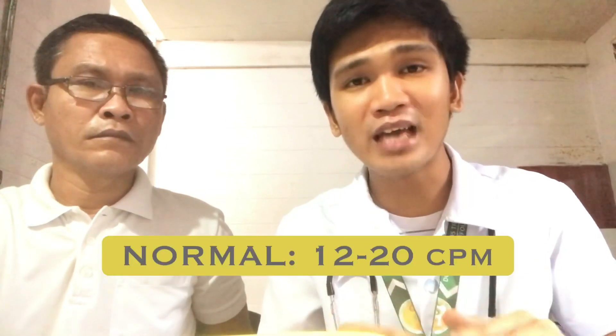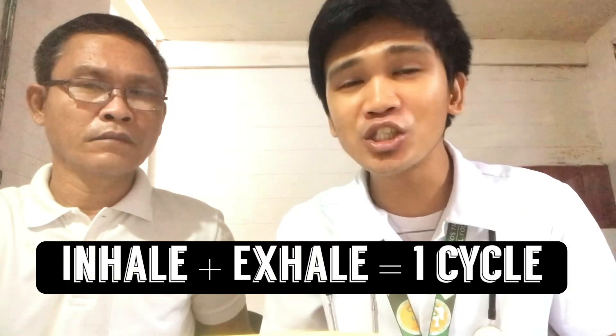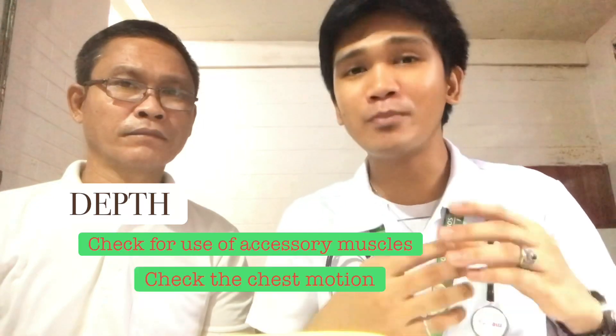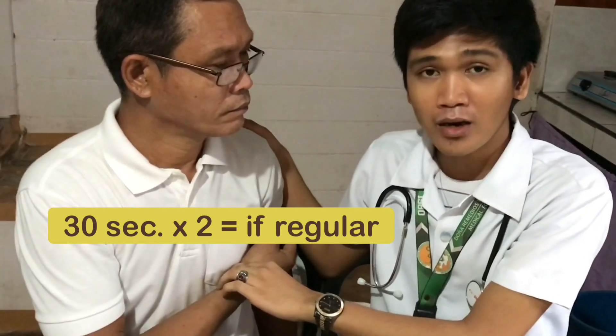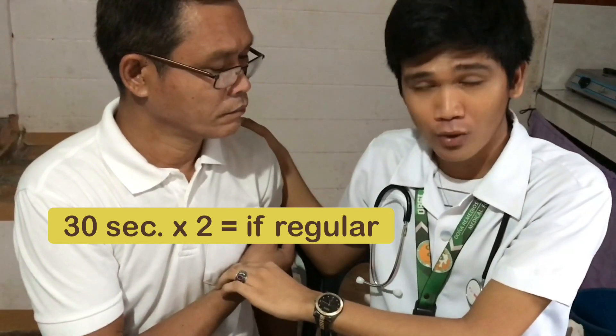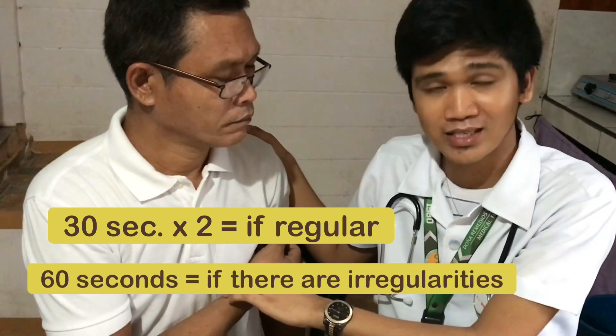Step number nine: check the respiratory rate. The normal respiratory rate is 12 to 20 cycles per minute — one inhalation and one exhalation equals one cycle. We also look for depth, which can be assessed by checking for use of accessory muscles and movement of the chest — that's why the patient's forearm is placed across the chest and one hand is on the patient's back, to check for deep or shallow breathing. We also check for rhythm: is it regular or irregular? Count for 30 seconds if the rhythm is regular and multiply by 2; if there are irregularities, count for 60 seconds. Then document the result.